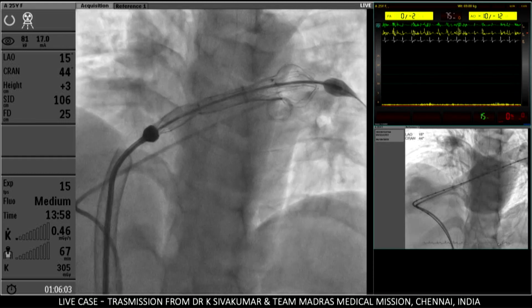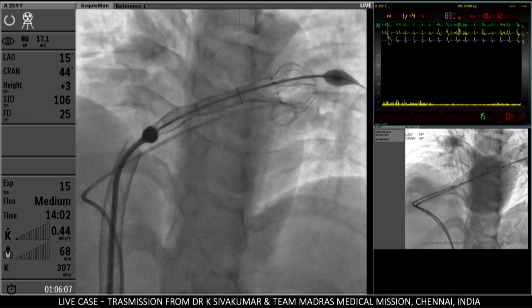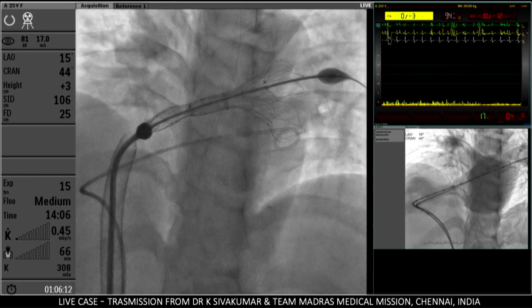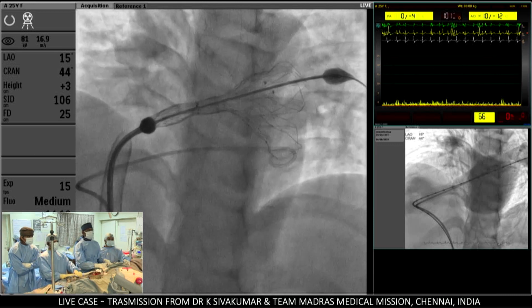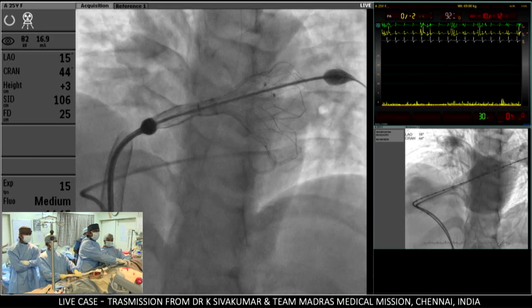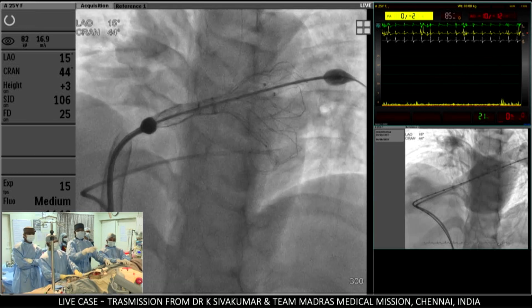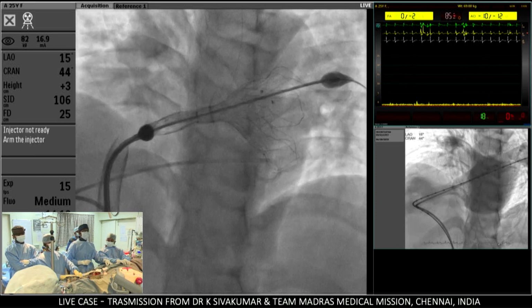Yeah, keep inflating. Well, I think the size of the main PA is so huge that I suspect the distal flare will be fully open in the main PA without having contact. Yeah. Stay there. Now show me. Get me the complete size. 20 at 18. 20 at 18.